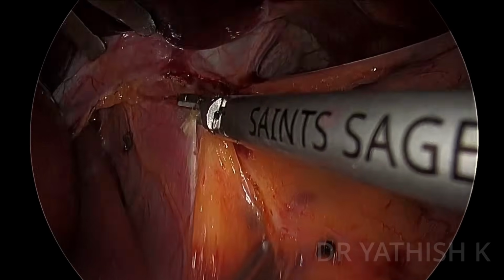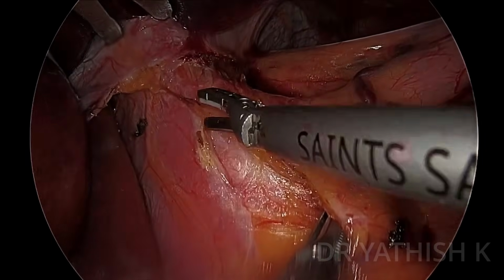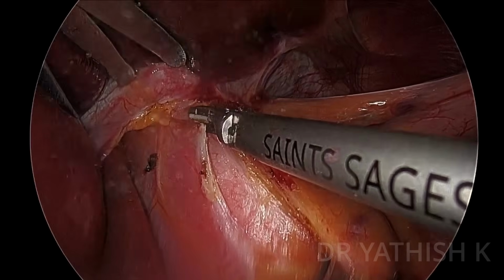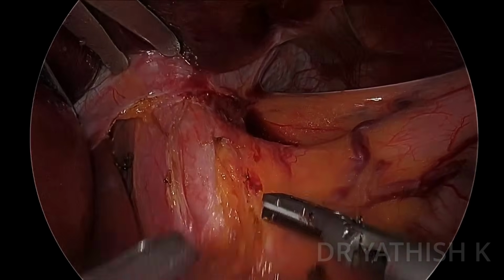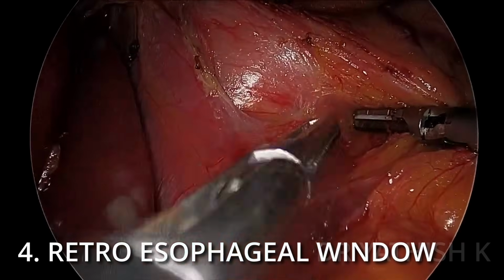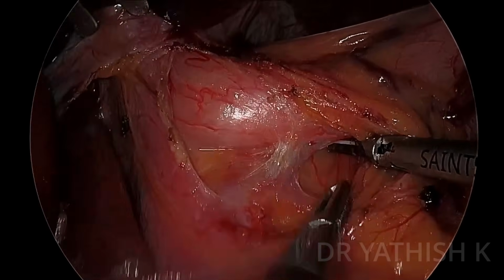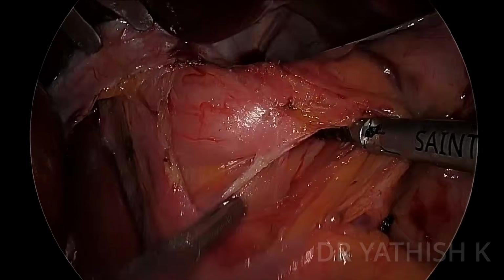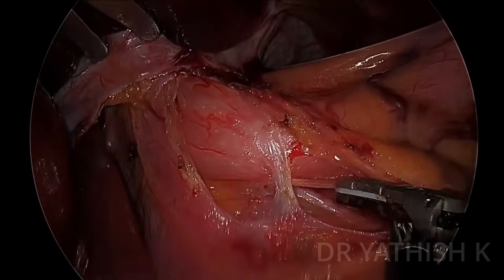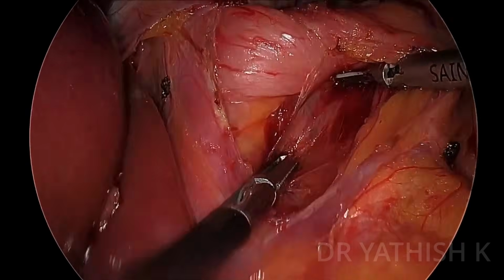And now I'm running my harmonic over the right crus to create a retroesophageal window, as this forms the landmark step in case of any hiatal repairs or any myotomy, because creating a retroesophageal window will adequately mobilize the fundus and it will help in a safe wrap creation.